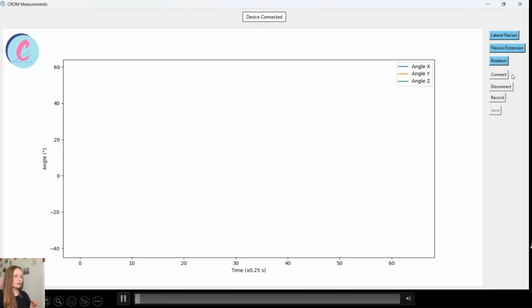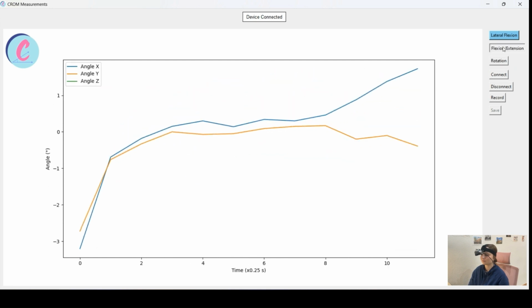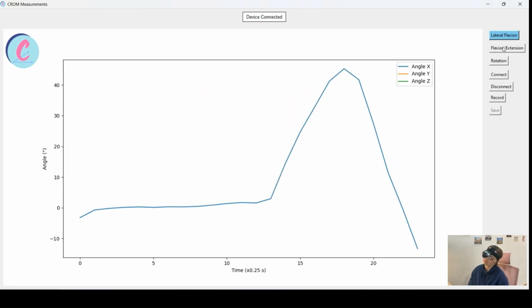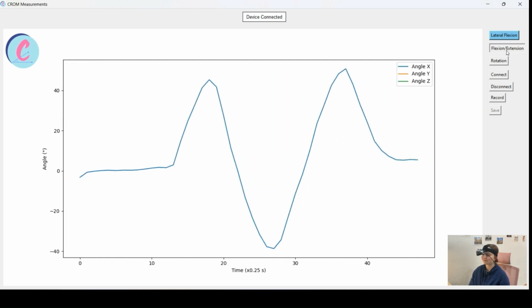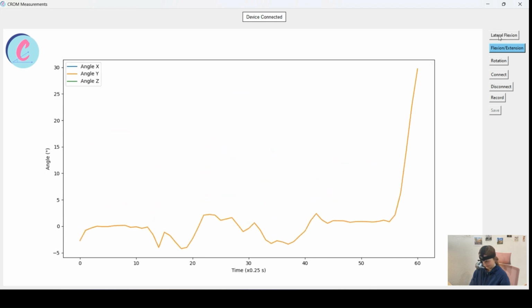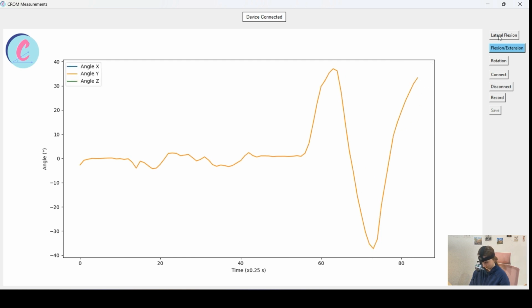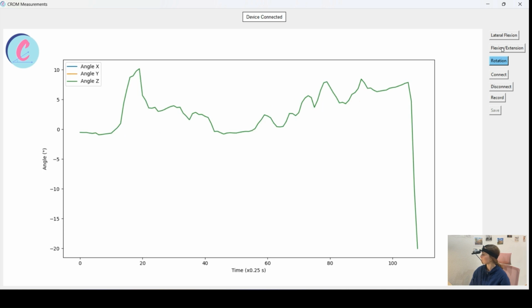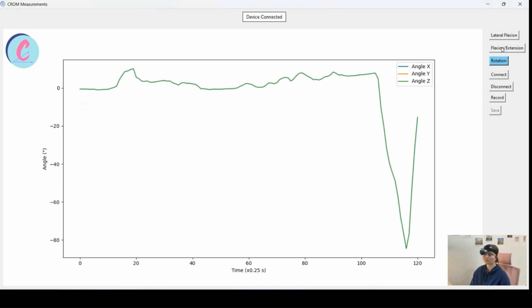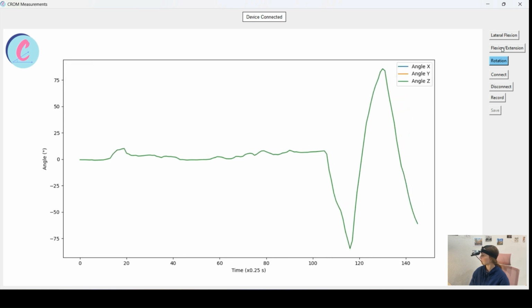Now, a video will be displayed in order to show the general functionality of the interface. We first connect the device, and all three plots are depicted at the same time. First, we're interested in the lateral flexion movement, which is the one performed by our participant, so we leave only that button selected. Now, for the flexion extension movement, the one performed by our participant, we deselect the first button and leave selected the button for that movement. We'll follow the same procedure for the rotation exercise, and we'll leave selected only the button called rotation.